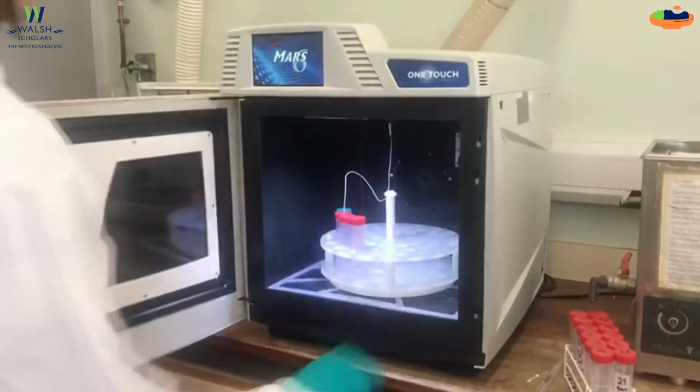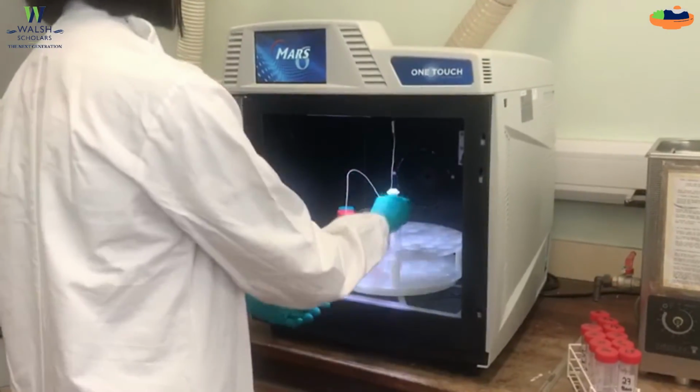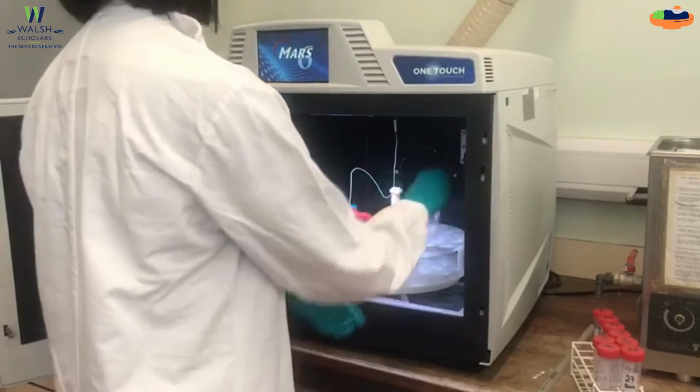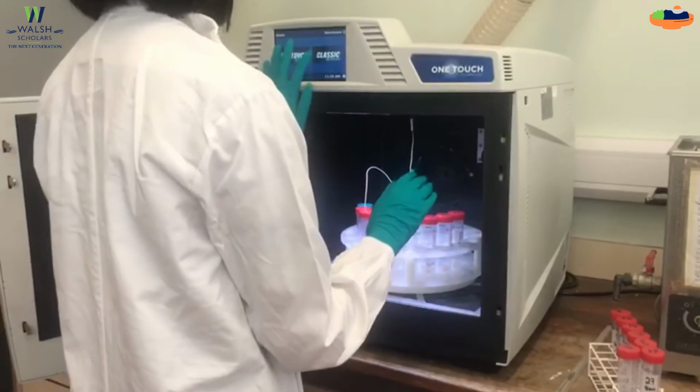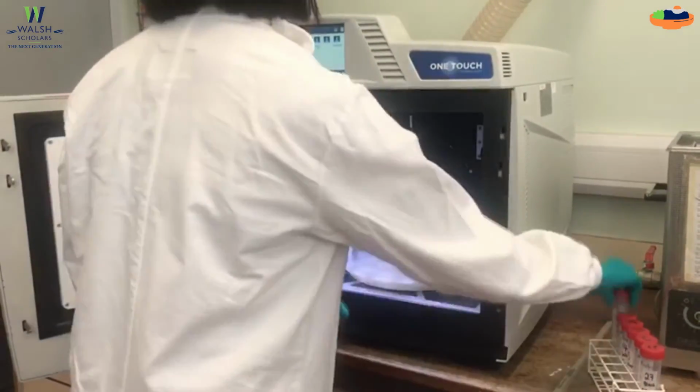I've also made changes to the sample preparation approach. So traditionally, the majority of methods for nitrofuran analysis include a 16-hour overnight derivatization step that takes place in a water bath. This step is crucial because it basically converts the residues into a form that can be detected by our instrument. I've swapped this out for a microwave-assisted reaction, which has reduced the derivatization time down from 16 hours to just 13 minutes.